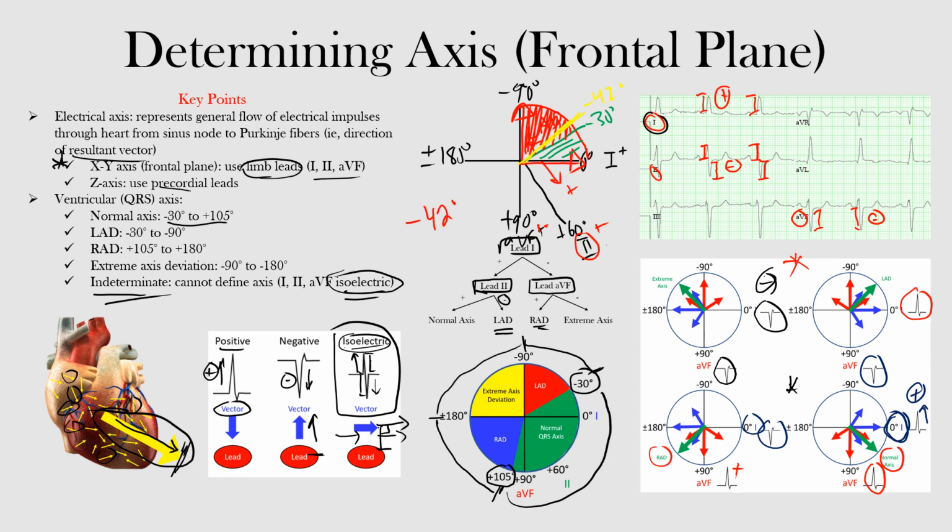All right, and then we went through all these methods in the examples, review them, but hopefully this is starting to make sense. Well, that's the end of this lecture. We discussed how to determine the electrical axis in the frontal plane. I hope you learned something.